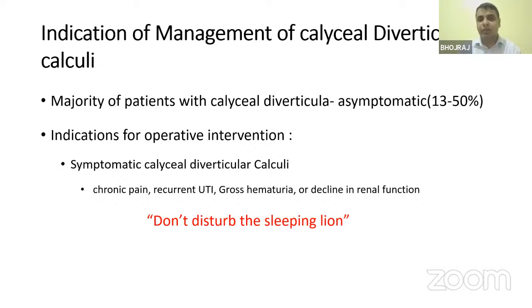The indications for operative intervention are only for symptomatic calyceal calculi, diverticular calculi, maybe due to the stone-related chronic pain, recurrent UTI, gross hematuria, or decline in renal function. Again, I would like to emphasize that for asymptomatic diverticular calculi, please don't disturb the sleeping lion. This motto we have to follow.